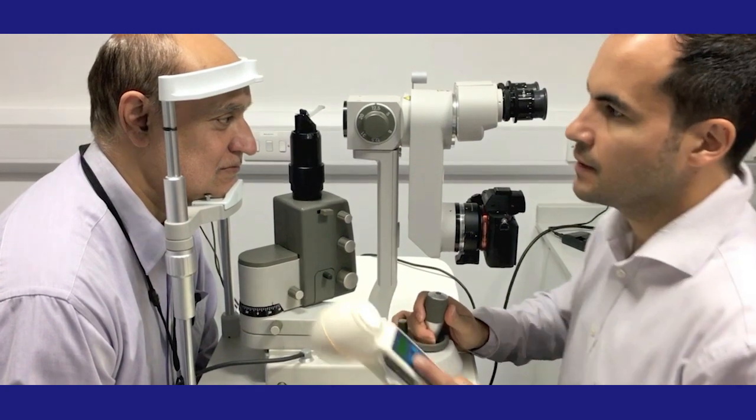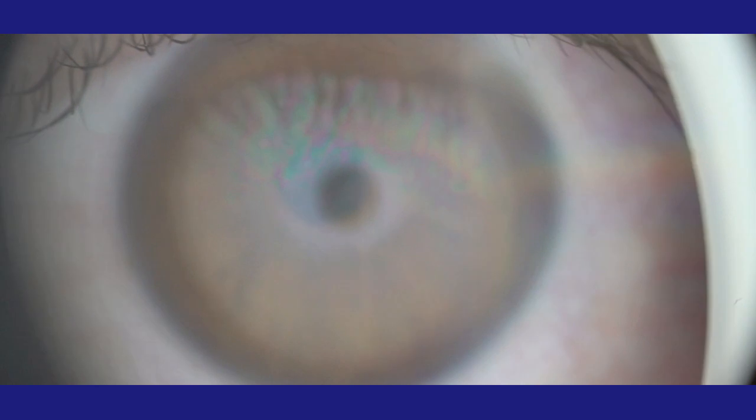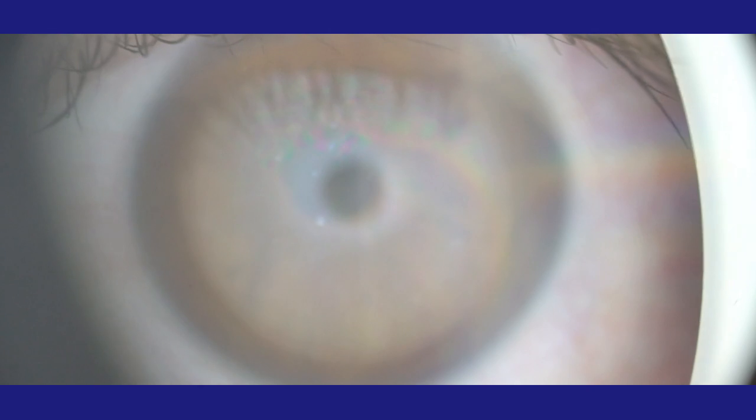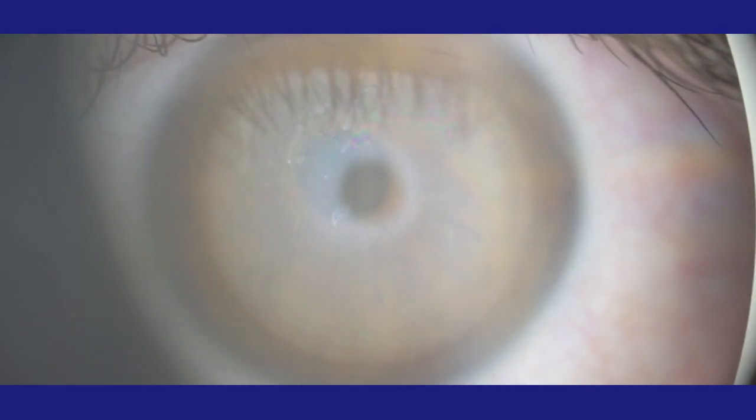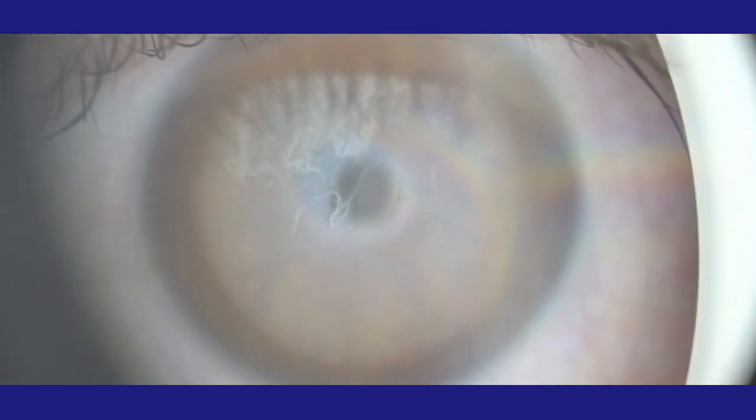Well, if we're lucky to perhaps be working in more of a research environment, we might have a device like this, a tear scope, which allows us to look at the lipid layer, the front of the tear film on the front of the contact lens, to see what's happening there. Do we have a stable tear film that's allowing for a well lubricated movement of the eyelid over the front of the lens? Or maybe something like this. Here we have the same patient with a contact lens in, and we can see above the pupil now a lot of coloured fringes coming into play here, as the lipid layer has variable thickness. The pre-lens tear film is thinning, and we have a less well lubricated system.